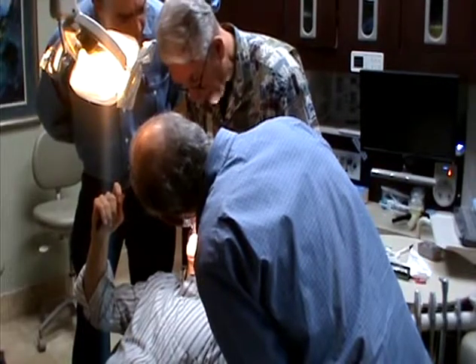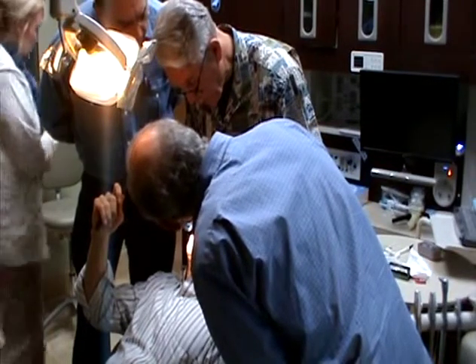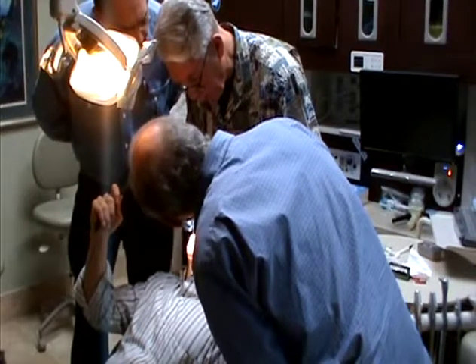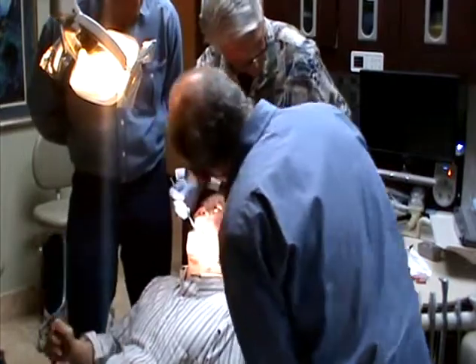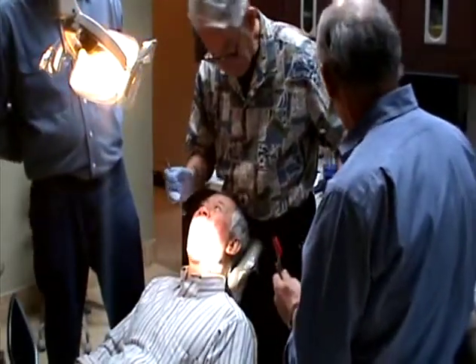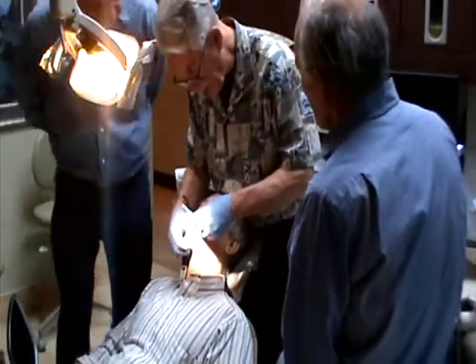And this thing, it's real close. The stop isn't in the middle of the tooth, it's out here a little bit to the side, but still he's going over this way. So what I'm seeing there is more of the centric stop than it is the balancing interference, is that it?